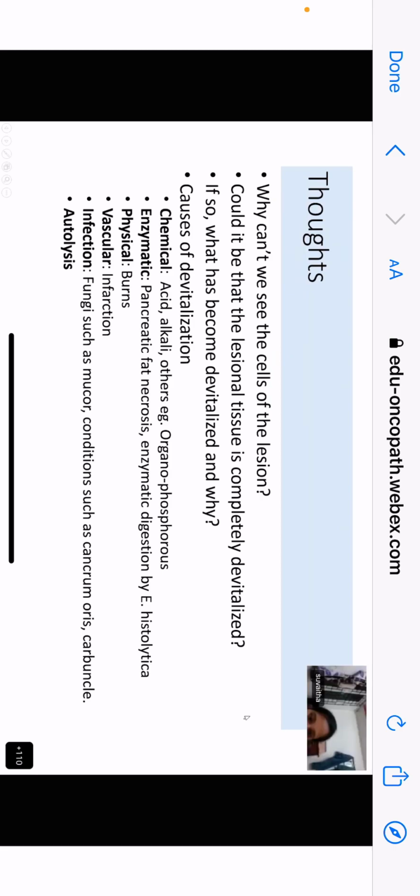What was your diagnosis before this discussion? Dia? Ma'am, I could not reach a diagnosis because I was not seeing the cells much. You couldn't see the cells because they're not there. And you don't think that I gave you something so badly fixed and so badly processed that I expected you to see something?